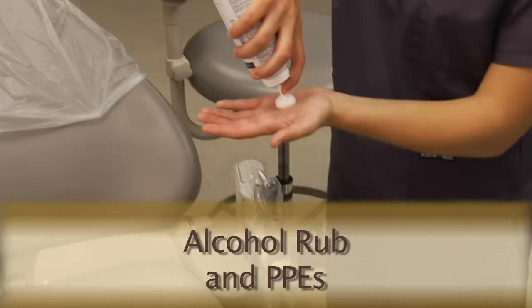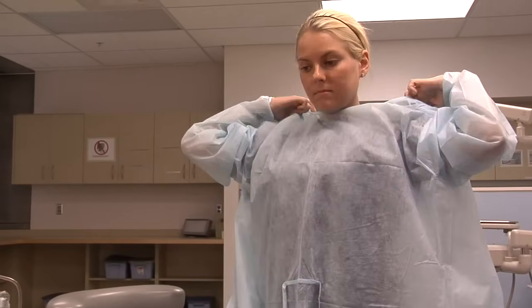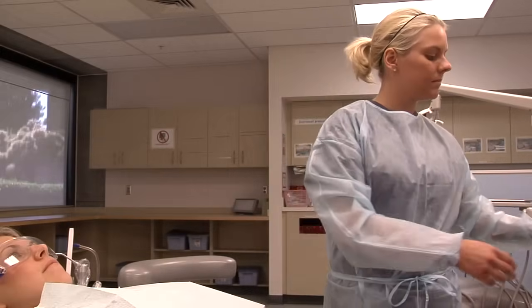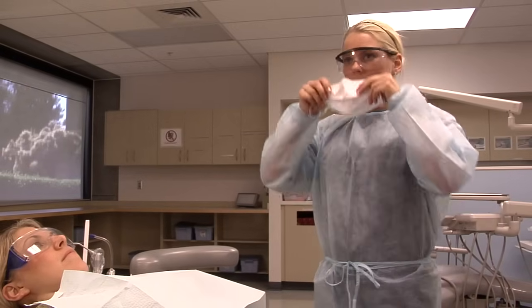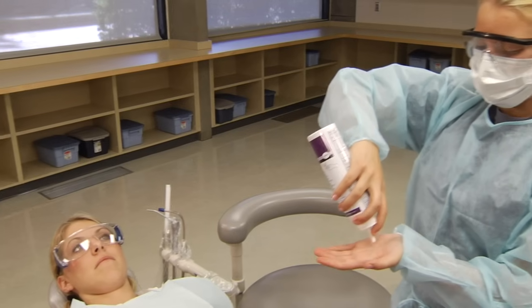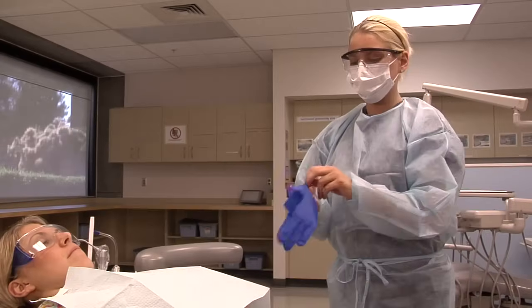The assistant must again use alcohol rub and don PPEs. They should be put on in the correct order, which is the gown first, then safety glasses, and mask. Use alcohol rub again, then don new gloves.